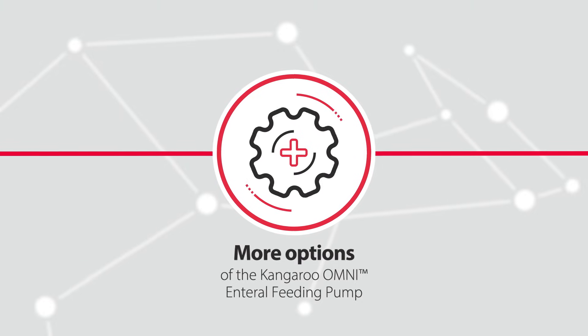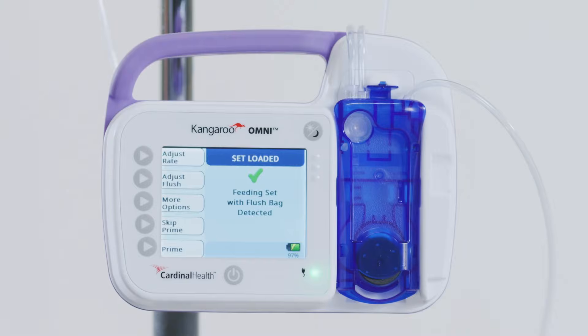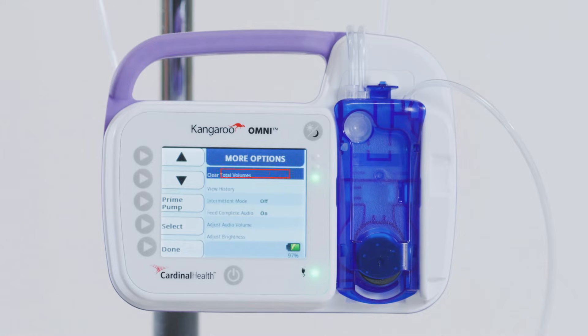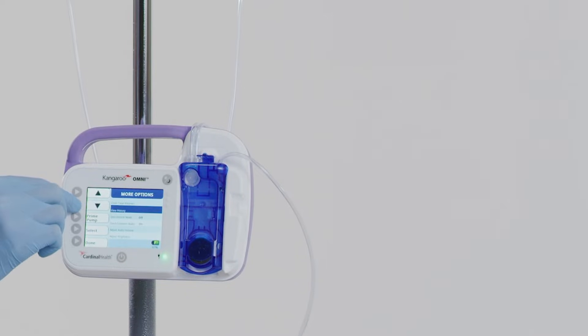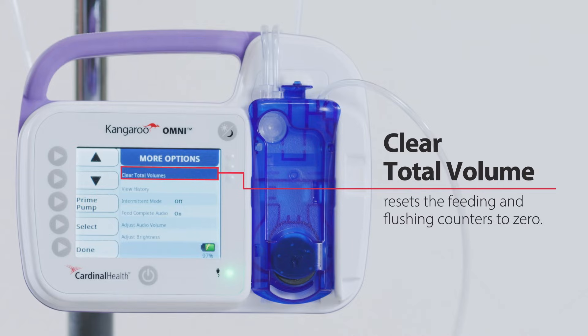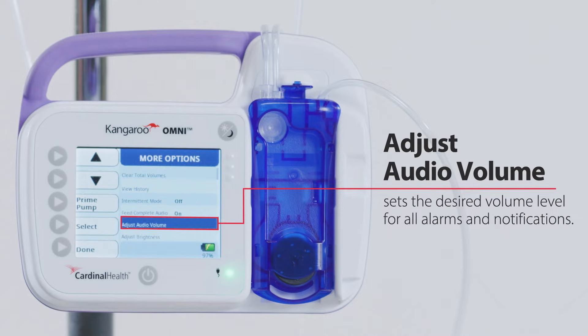Accessing More Options of the Kangaroo Omni enteral feeding pump. From the Set Loaded screen, press More Options. On the More Options screen, you can clear total volumes, view history, enable intermittent mode, turn on or off feed complete audio, adjust audio volume, and adjust brightness. Use the arrow keys to highlight the feature you want to activate, then press the Select button to activate it. Clear total volume resets the feeding and flushing counters to zero. Adjust audio volume sets the desired volume level for all alarms and notifications.